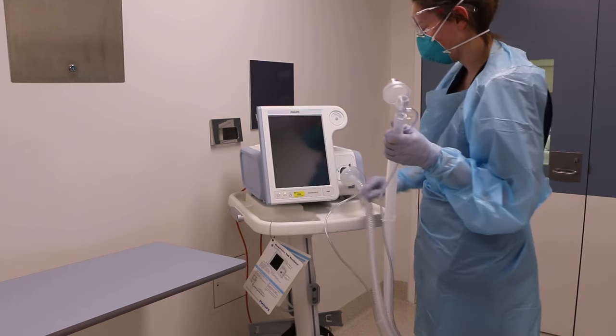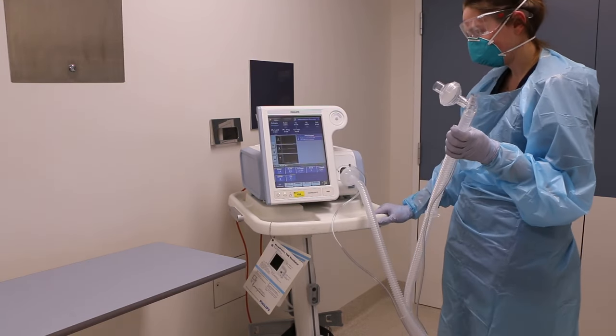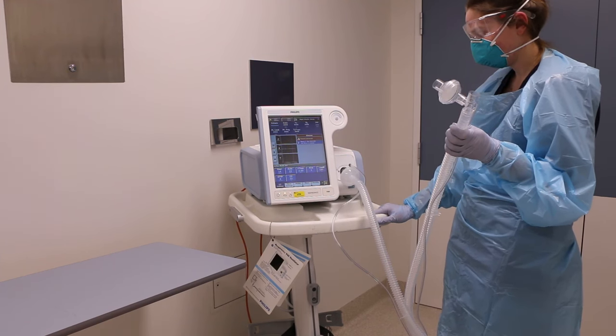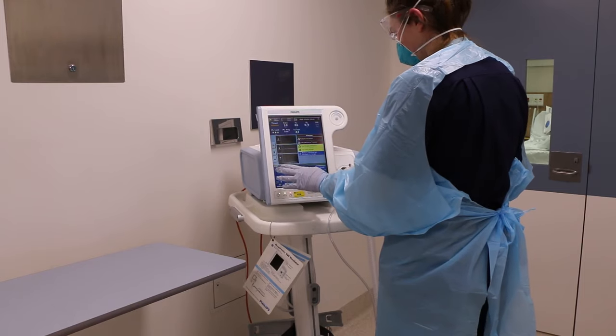Setting up of the circuit and the NIV machine is to occur outside the patient's room. The NIV settings will be entered as per medical orders. Once complete, leave the NIV machine in standby mode.